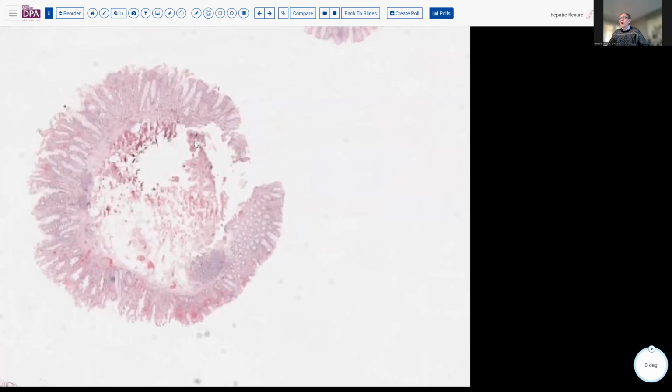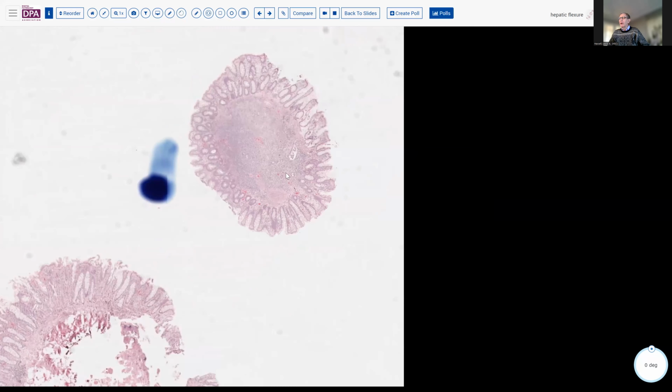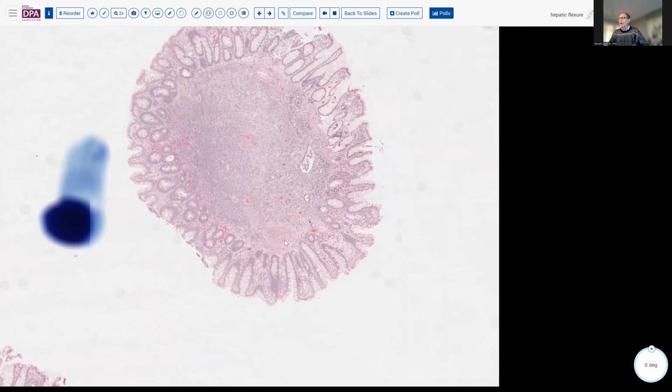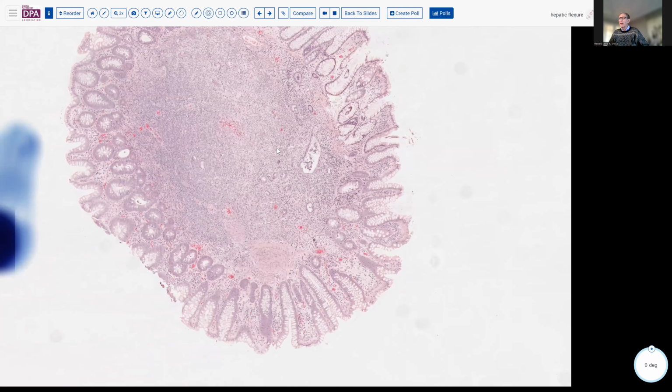And this last fragment up here that was nicely highlighted also showed a few of these scattered glands deep to the muscularis mucosa. Here, as you can nicely see, this delimiting muscularis mucosa, and these glands are beneath that with some associated cellular stroma.